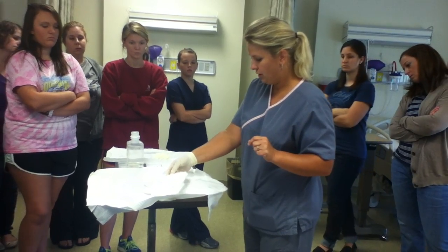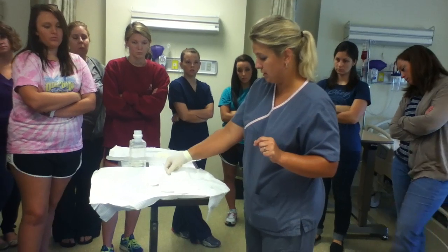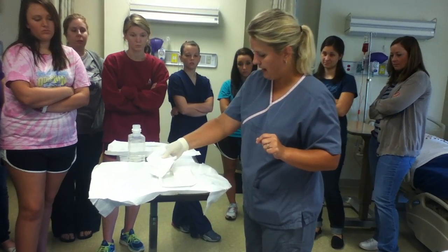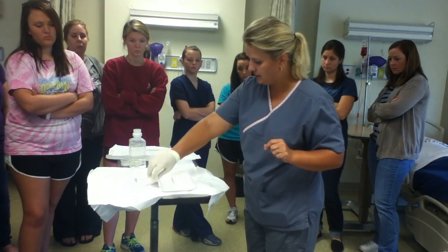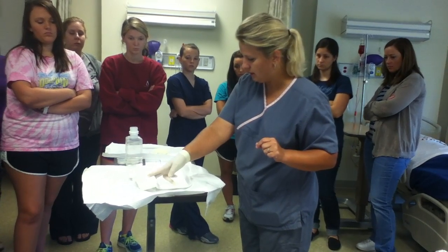Now, you can move this stuff around however you like. I call this the meat tray because it looks like a meat tray. You have 4x4s in here, you have tape, and you have an ABD pad. The tape does sometimes want to stick. Okay, remember my 1-inch borders, I'm keeping everything kind of centered. You need to take the ABD pad out and just kind of find you an area to sit it.